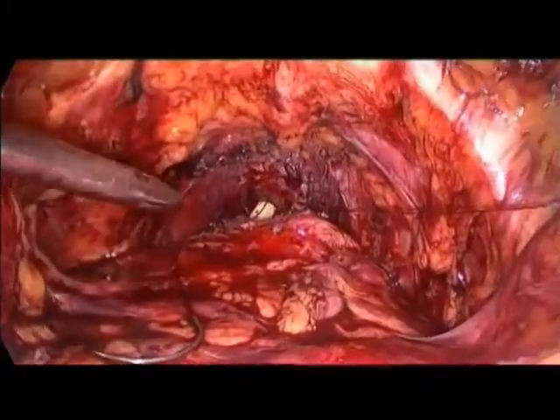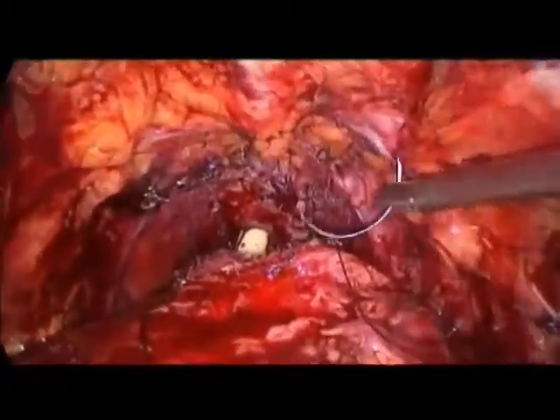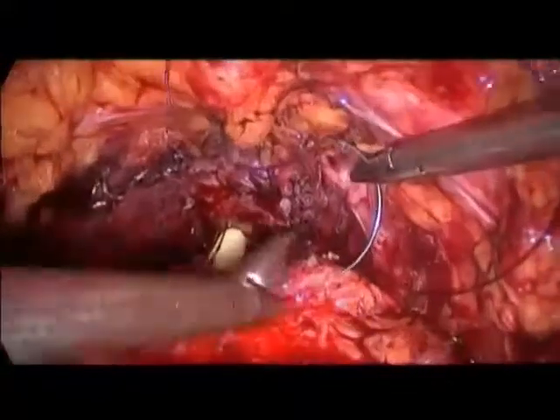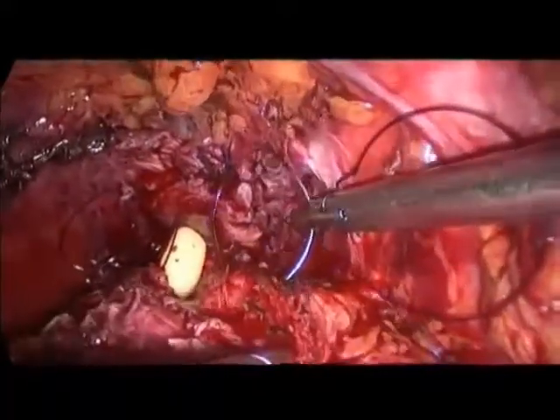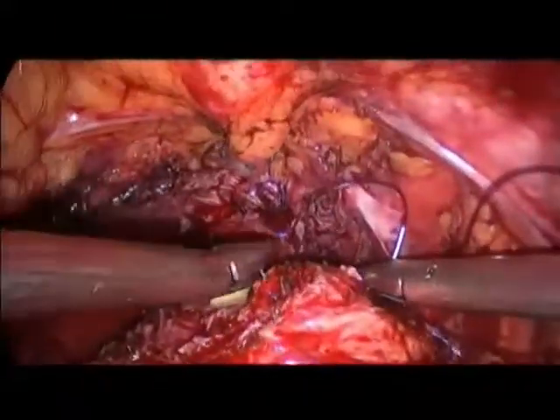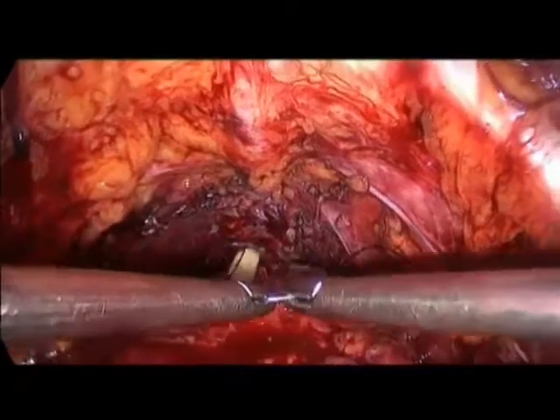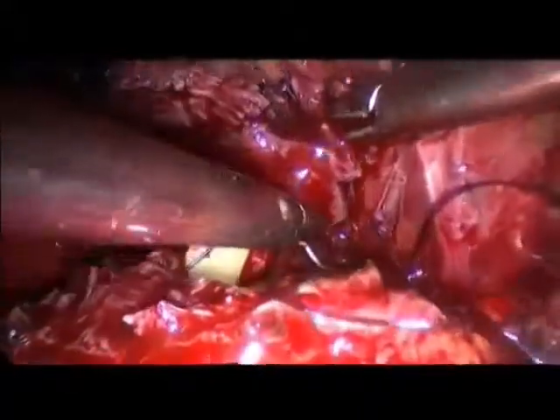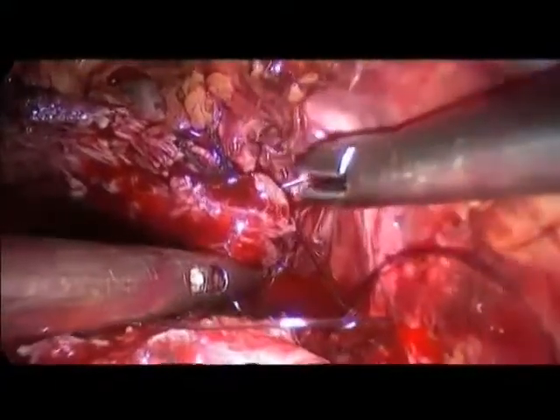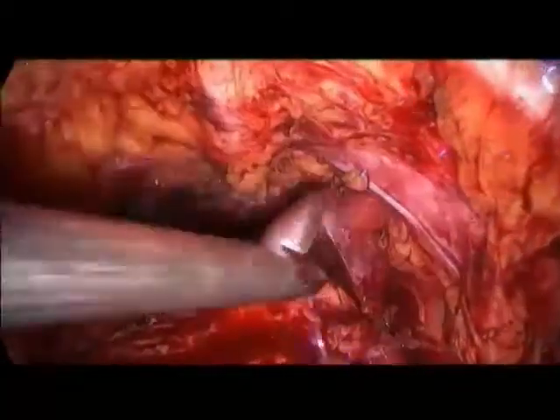I think the running suture is an advantage to proceed quickly. So when you just focus on one side and then you go just to the middle edge, you can use the advantage of pulling on the thread and thereby approaching the tissue better. Well, it helps you, in my hand, a little bit to speed up the procedure rather than always taking a new needle from the other side. No, but as long as we don't have troubleshooting problems, which happen in 1% of cases in the survey where we have tested the model on the long term in several centers, the suture takes 20 minutes on average.